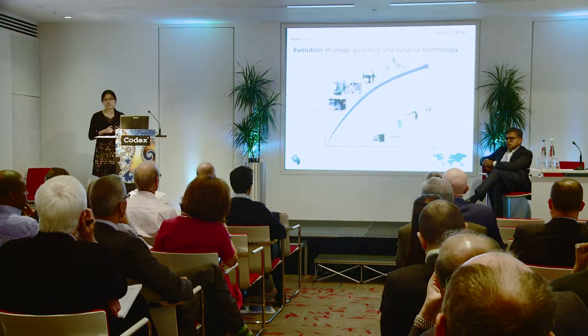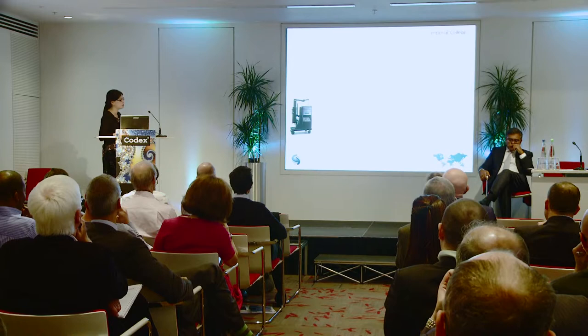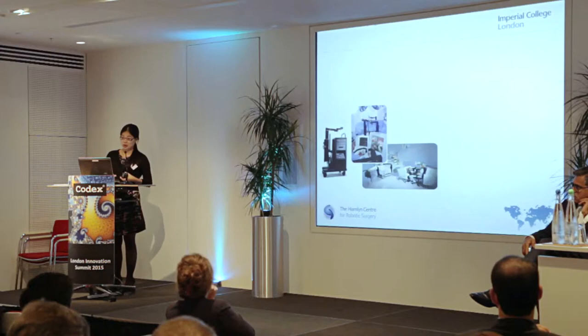And I think the technology has kept up with that, and we now are able to do these kinds of procedures. Just to go through in terms of commercial devices and robotic technologies, this, for example, is the Zeus. It was one of the very first clinically used surgical robots for laparoscopic surgery. The picture size here doesn't seem to indicate it, but it is one massive, big robot that's no longer in use. You might recognize this.